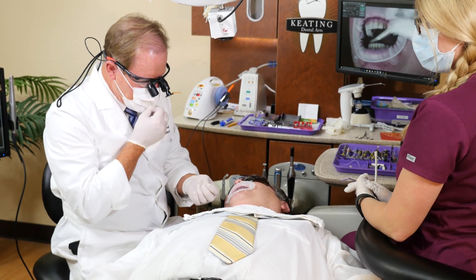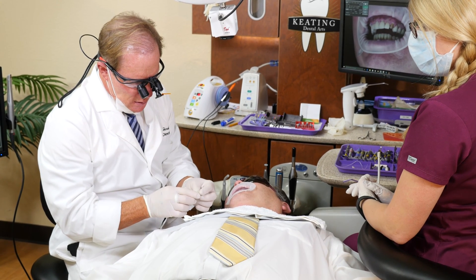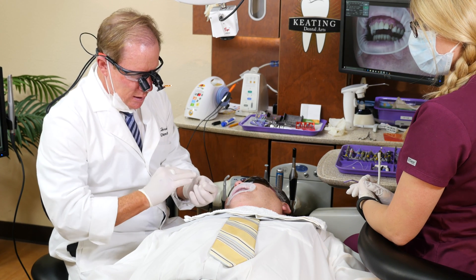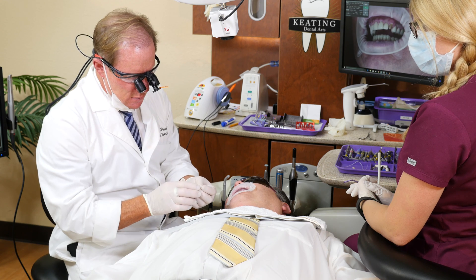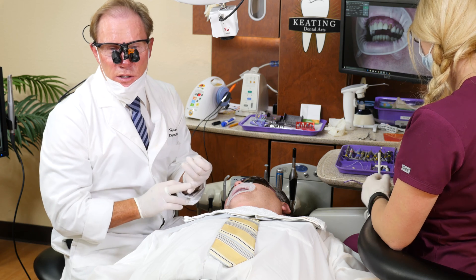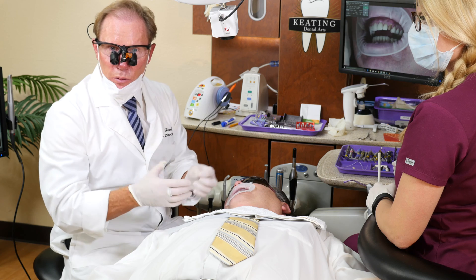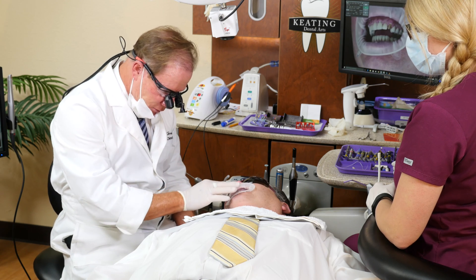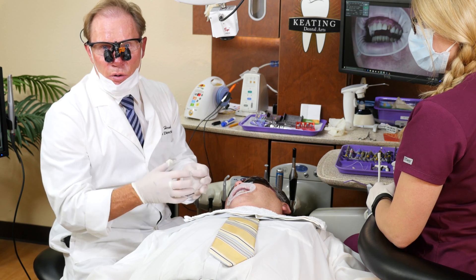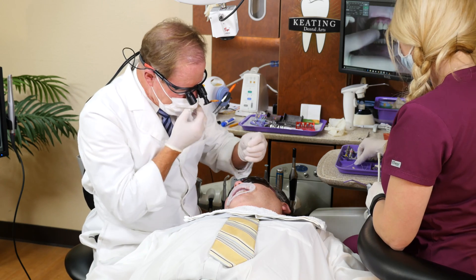Here is our KDZ Bruxer Ultra. It's a zirconium dioxide coping or core, just like a PFM would be, and then it's overlaid with Noritake porcelain. We use this material because it's the most aesthetic of any of the zirconium materials. Kim has a full mouth rehabilitation done previously, all done with zirconia overlaid with a powder-liquid ceramic, so we wanted to match that. Let's go ahead and try it in.